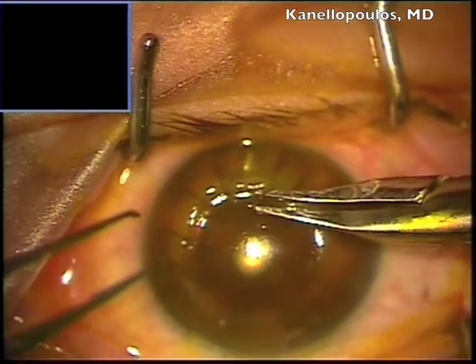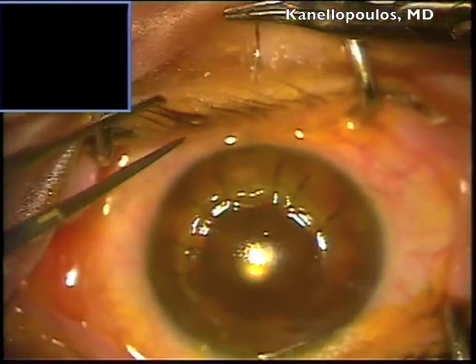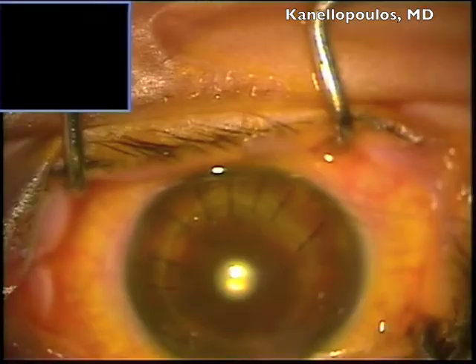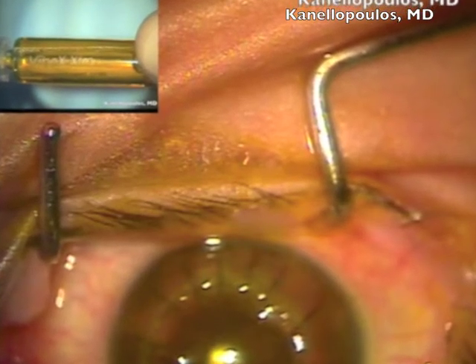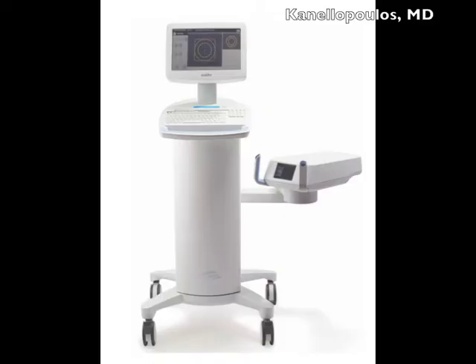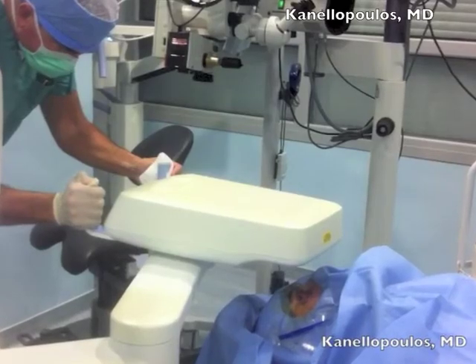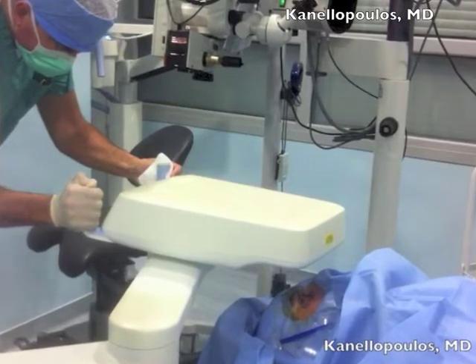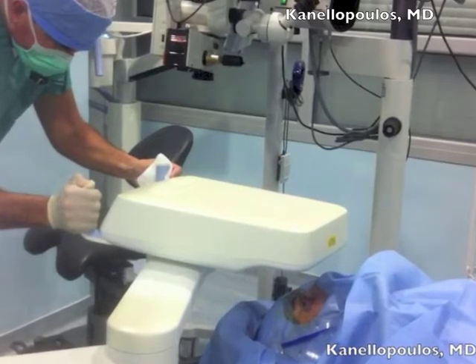You probably suspected that following this, I will perform a cross-linking session in order to reinforce the host cornea that has significant ectasia. At the end of placing the sutures, I will place even more Vibex Extra 0.3% riboflavin — this is a higher concentration — and come to the KXL2 device by Virdro. We'll place it with the patient's eye; it has a tracker, and you'll see why, because the cross-linking here will be performed with very high fluence — 30 milliwatts — for a total of 15 joules delivered at the periphery of the cornea.